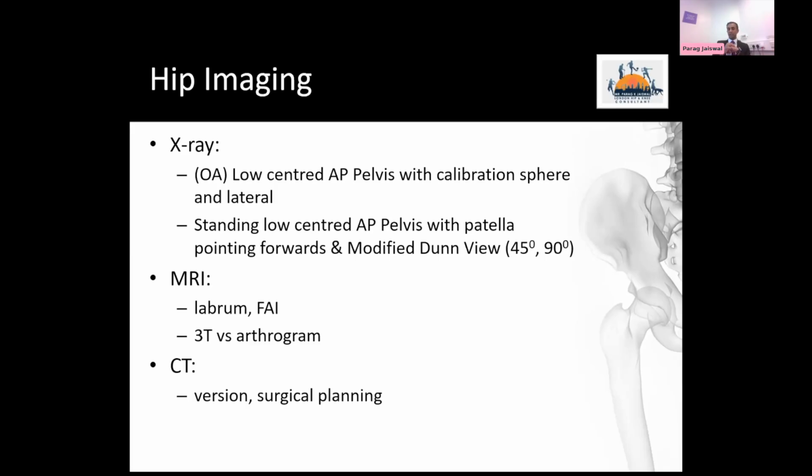The one I like to use is MedNeo, which gives absolutely stunning images. And because of that, I'm doing far fewer MR arthrograms to determine if there's a labral tear, which is obviously a lot of benefit to the patient because they don't have the discomfort of having a needle jabbed into their hip joint.